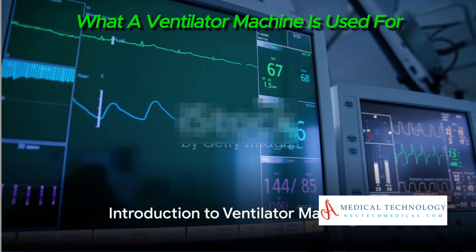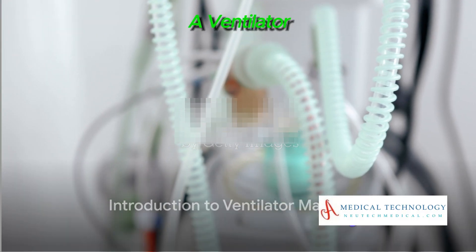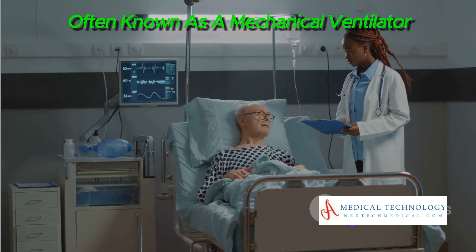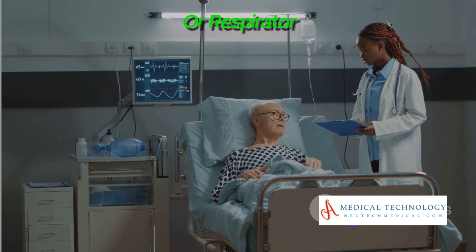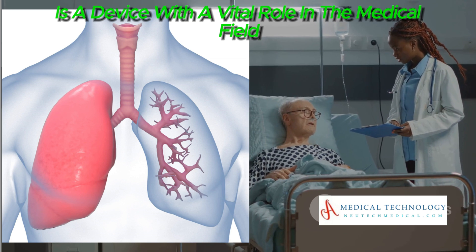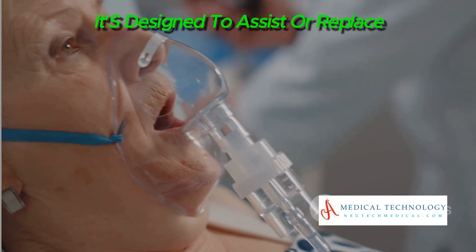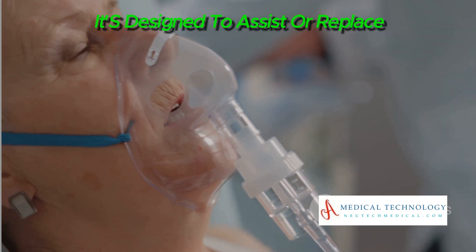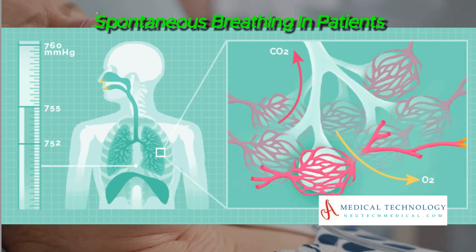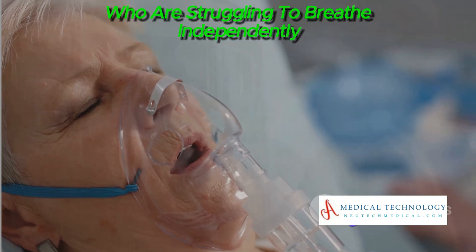What is a ventilator machine used for? A ventilator, often known as a mechanical ventilator or respirator, is a device with a vital role in the medical field. It's designed to assist or replace spontaneous breathing in patients who are struggling to breathe independently.